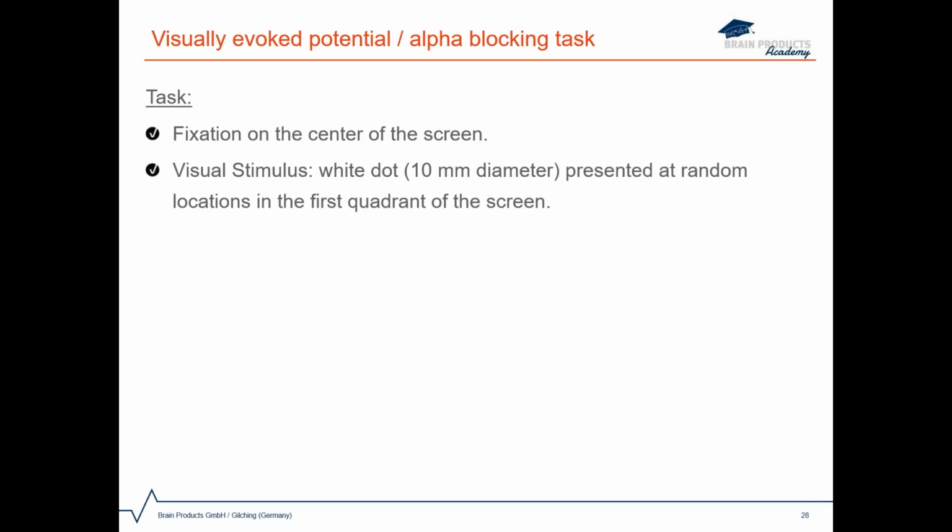underlines what different results we can receive if we look at evoked power, which is time and phase locked, or induced power, which is non-phase locked. First, let us consider the evoked power.